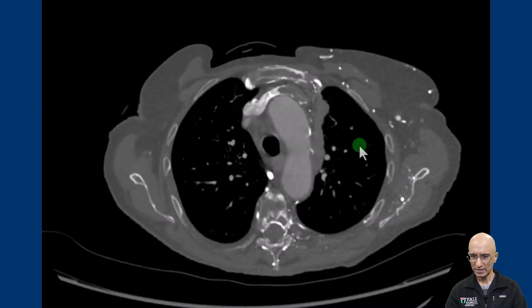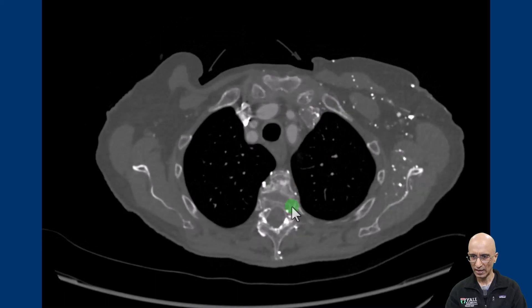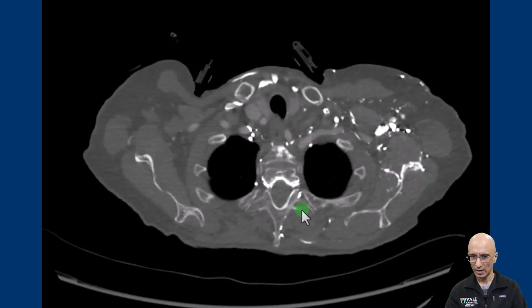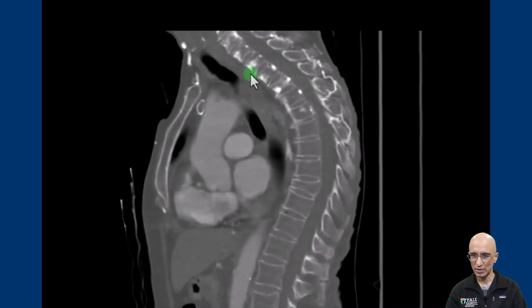On the bone windows we can see some sclerotic foci in the upper thoracic vertebral bodies. Pulling the sagittal images, on the sagittal images in bone windows we can see multiple sclerotic foci in the upper thoracic vertebrae, which was new compared to the prior CT examination performed a few months ago. Given the new appearances of the sclerotic foci, there was concern for sclerotic osseous metastasis.